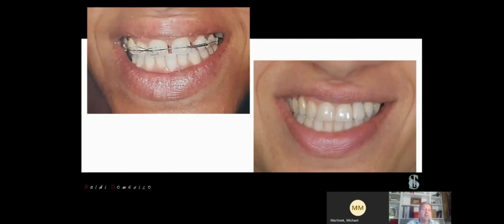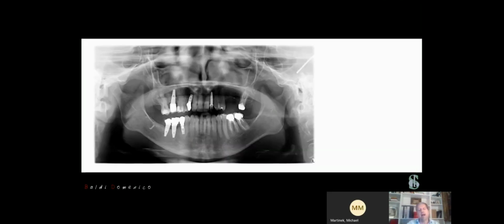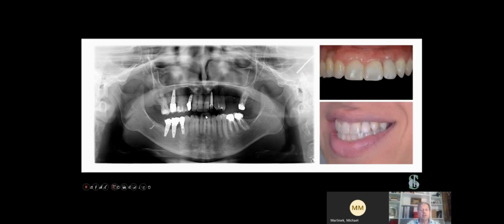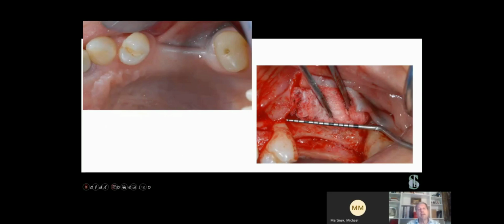But you can see here the smile of the patient before the ortho treatment, before the surgery, and after the surgery. And now we decided to make the rehabilitation of this posterior part. Now you can see the anterior part. And as I told you, we decided to make the rehabilitation of this posterior part.